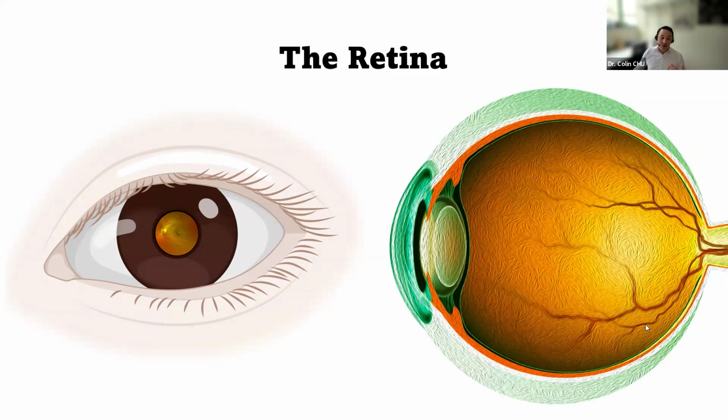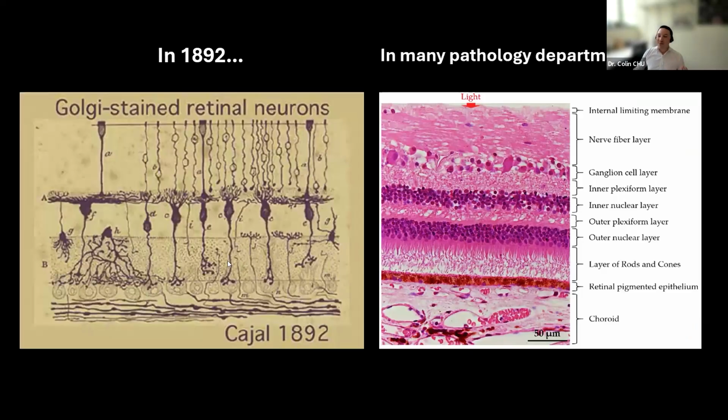And I was interested during my training about learning to access more information, not only from the retina in life, but also in post-mortem samples. And that's what took me to the NIH to work with the team there. And we can do histology on the retina in the same way as you might with your own tissues. And really, we have come a long way, but it's been a long time since Cajal's beautiful hand drawings down the microscope to then H&E staining as shown on the right, that is still the mainstay of most clinical departments using hematoxylin and eosin, or H&E staining.